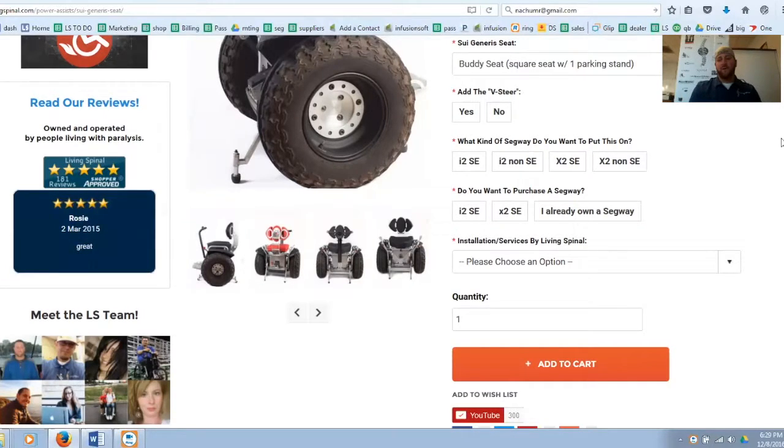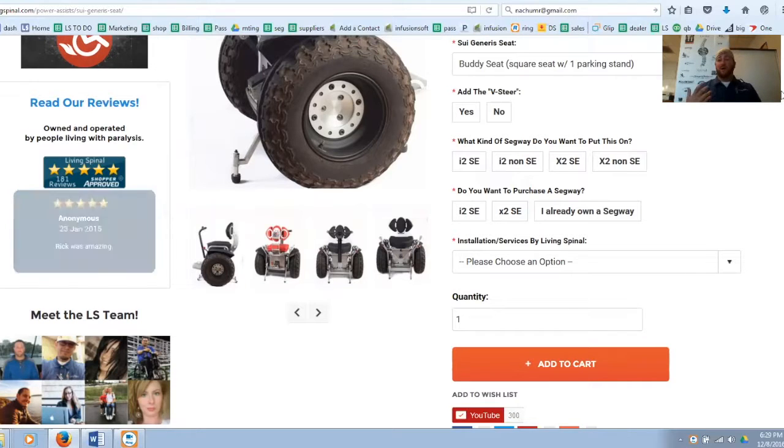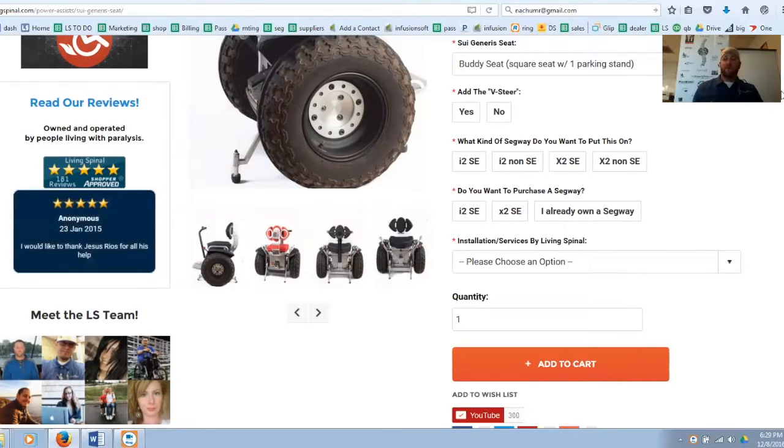For Segways, you want to keep them plugged in all the time, and they actually have a really neat technology package that keeps the Segway operating its batteries and keeping them clean all by itself. If someone owned it before you and just left it in a garage for 3 months at a time, they very well could have damaged the battery just that one time.